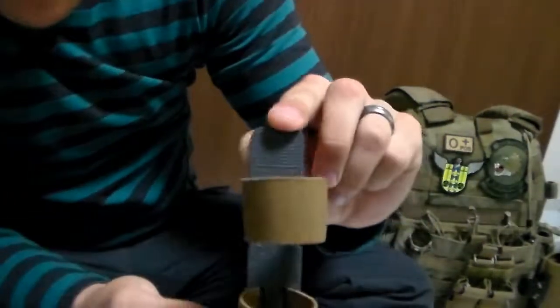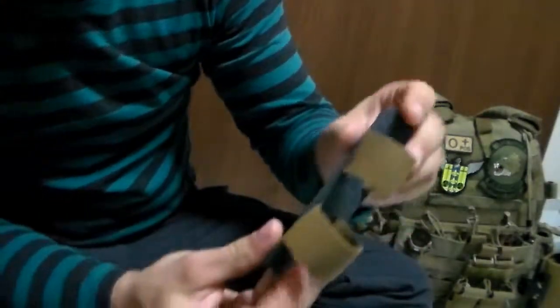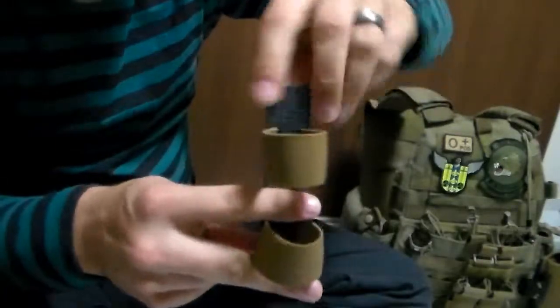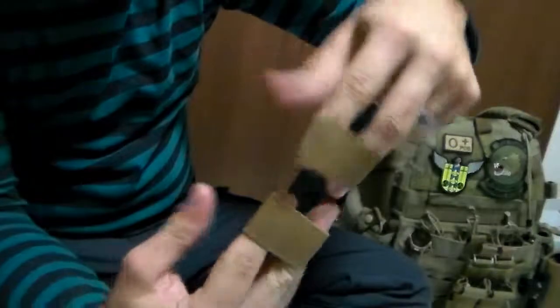The first one I ordered, made in the USA, is the Blue Force Gear Tourniquet Now. Basically, this will just sit over three bits of MOLLE, covering these areas here, and then the tourniquet will sit within these bands.